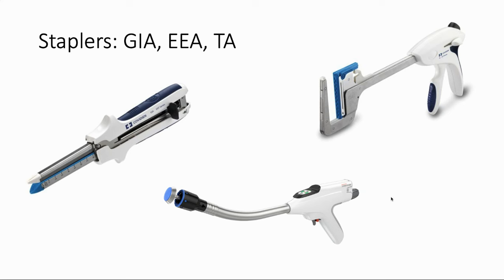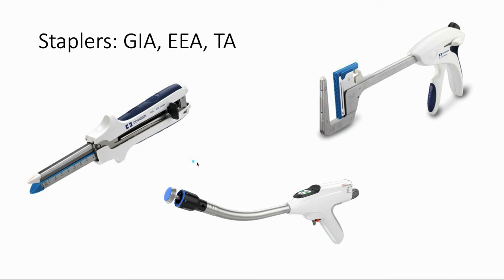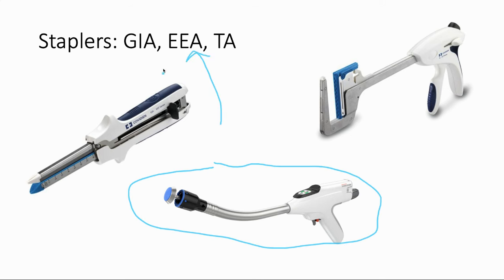Here we have a couple of different types of staplers. I always got confused by these letter combinations, but once you have it explained it's pretty easy to remember. The GIA stapler — which stands for gastrointestinal anastomosis — is a linear cutting stapler used in the abdomen when we have to cut out and make connections between different pieces of bowel. The EEA stapler stands for end-to-end anastomosis, and that's exactly what it's for — making an end-to-end anastomosis in two pieces of bowel.